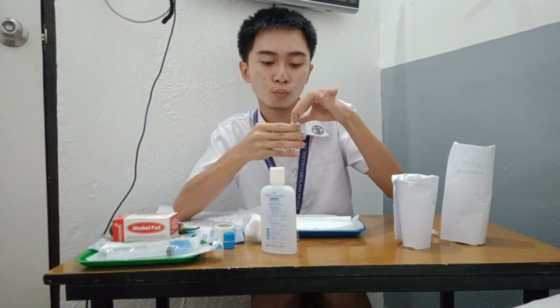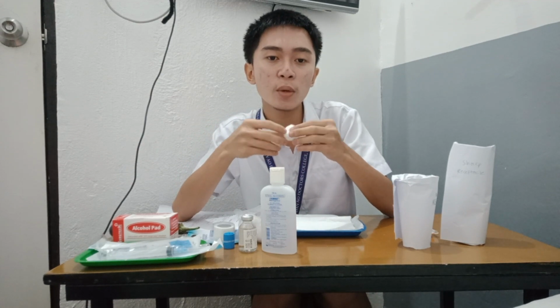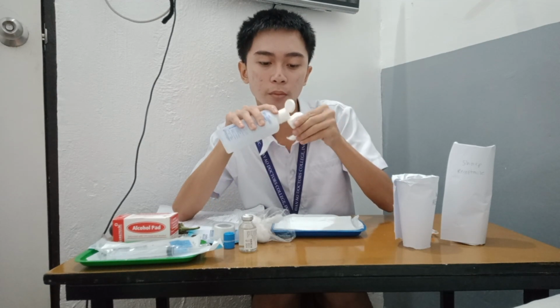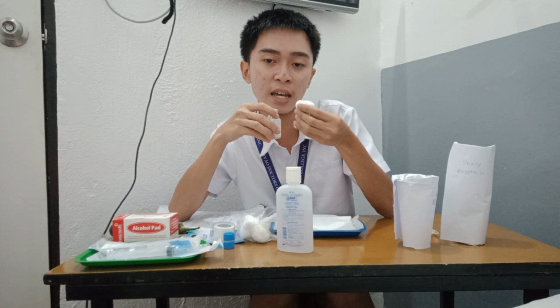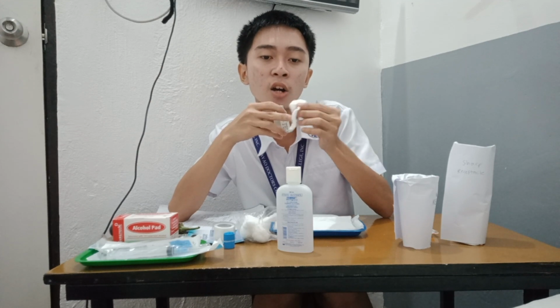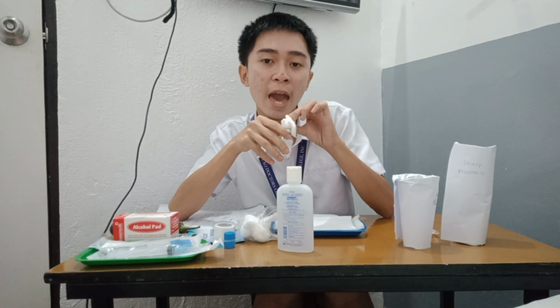Mix the solution if necessary by rotating the vial between the palms of the hands and not by shaking. And remove the protective cap. And clean it with an antiseptic wipe or by rubbing in a circular motion. So I already opened the covering of the vial, and I'm going to clean the rubber cap with the use of the cotton balls which are soaked in alcohol in a circular motion, and discard the cotton ball.